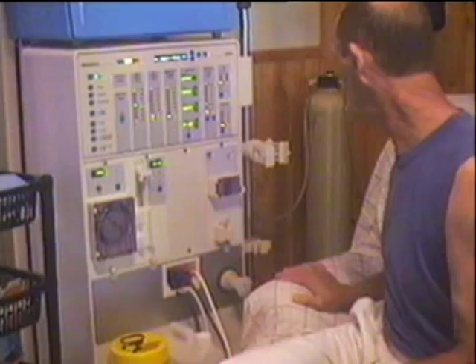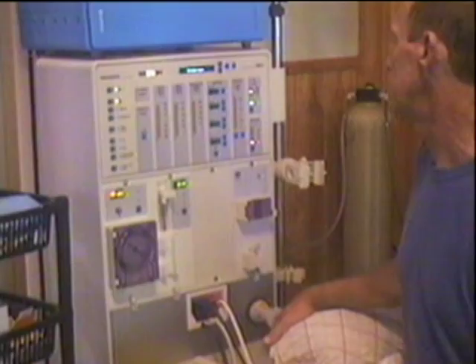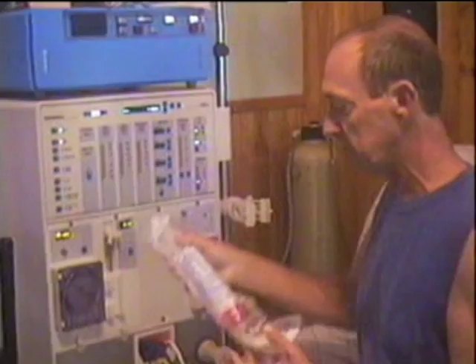What the machine's going through now is just an initial checkup — it's checking its systems. Everything's come up okay. Now I'll put it through a rinse cycle, which rinses all the internal tubes and various things inside the machine. That takes 16 minutes, so during that time I'll start setting up.